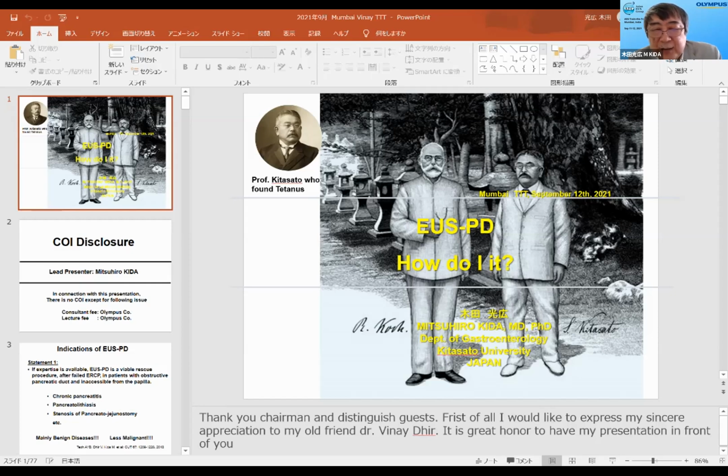Sometimes we cannot pass the papilla. Then we insert the guide wire into that space that looks round. Then we keep the hard part of the guide wire. So I recommend you puncture from the body and the tail. But sometimes we puncture the tail side. But in this case, we also need a space for the guide wire.